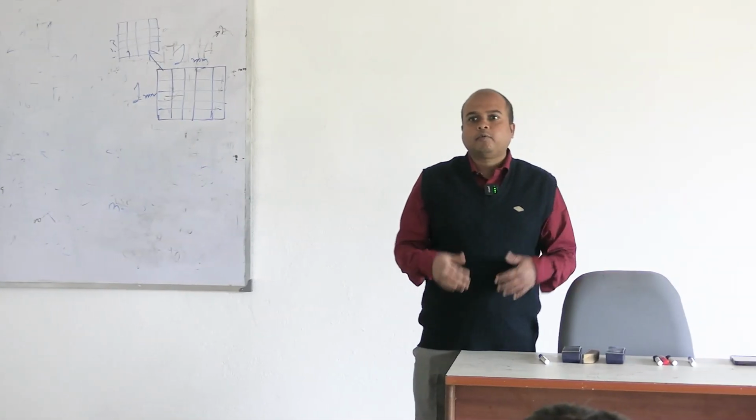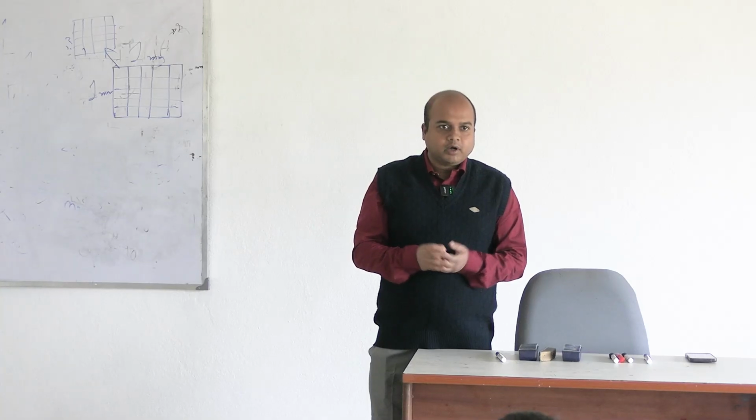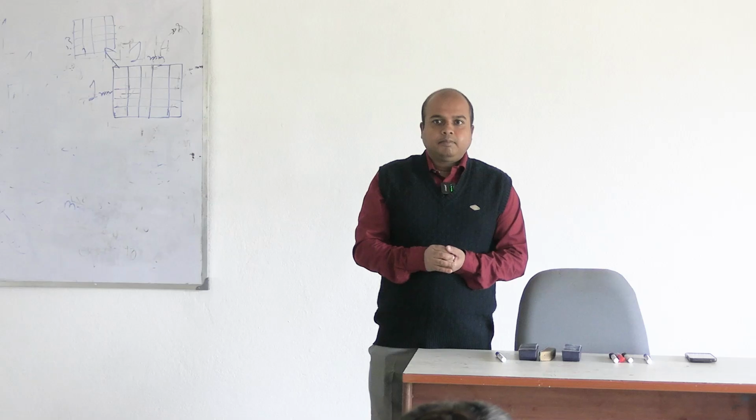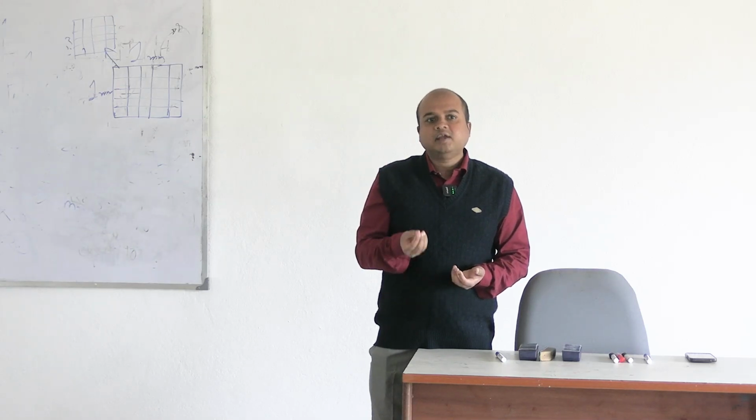So, to count cells, if I take blood up to 0.1, will it contain many cells? No, maybe very few cells. If it is 0.1, theoretically 101 minus 1 by 0.1 is the dilution. But actually what is happening is most of it is fluid and very little blood.